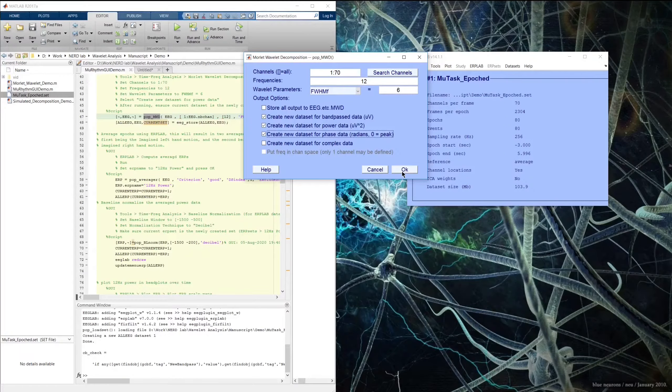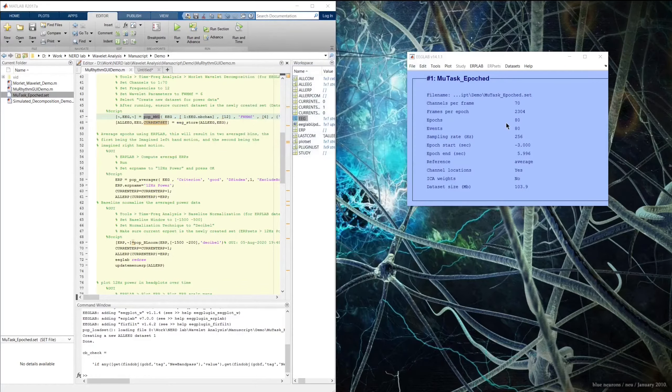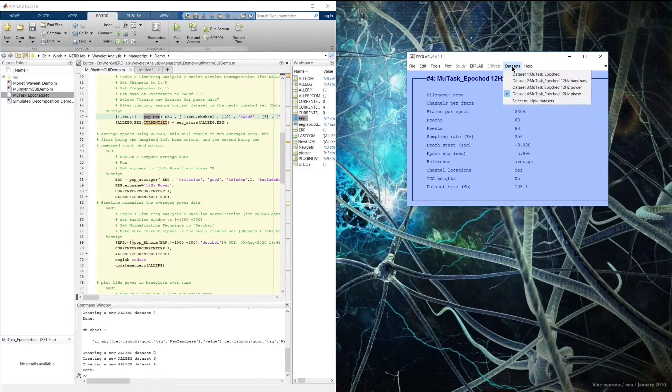Now we're back to extracting the 12 Hz bandpass, power, and phase from all channels. Running this, we see three additional datasets: 12 Hz bandpass, power, and phase. The phase can be viewed in the channel data scroll — quite dizzying to look at, but useful for certain purposes. Same with the bandpass data, which is basically as if we had applied any other bandpass filter. But the 12 Hz power is really the only thing we are interested in for these purposes.